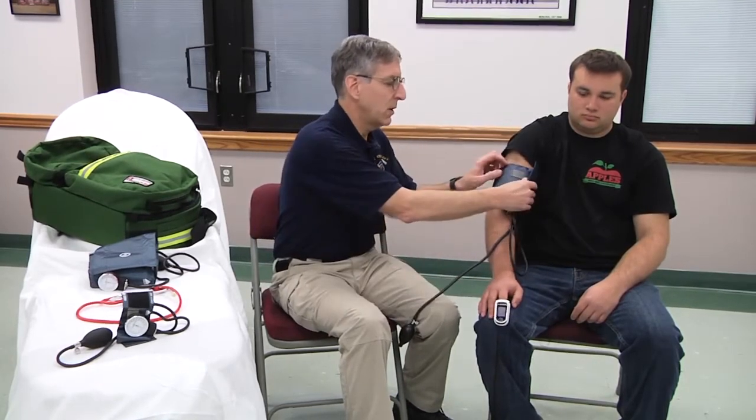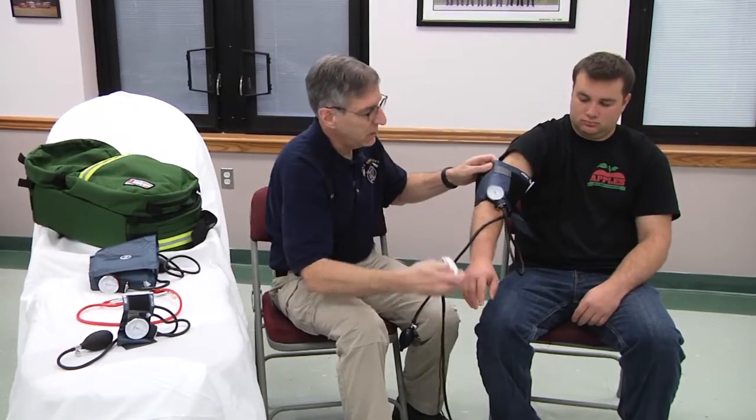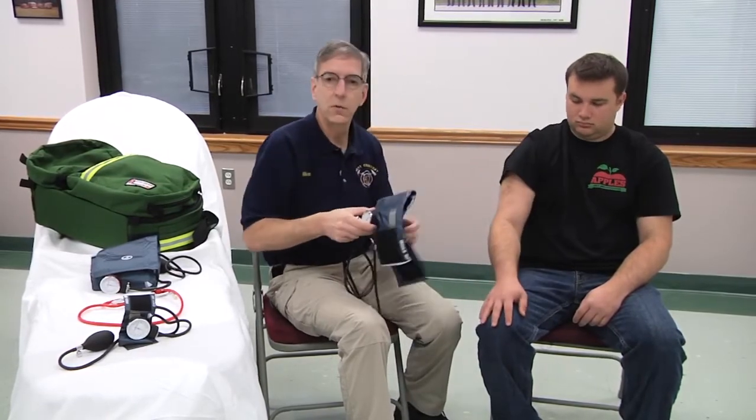The last thing I want to talk about is patients where it's impossible to put a blood pressure cuff on the upper extremity where we'd normally measure pressure — for example, a trauma patient who has fractures to both arms, or a very small pediatric patient where the upper extremities are extremely difficult to cuff. In very young children and newborns, we'll often measure pressures in the legs.